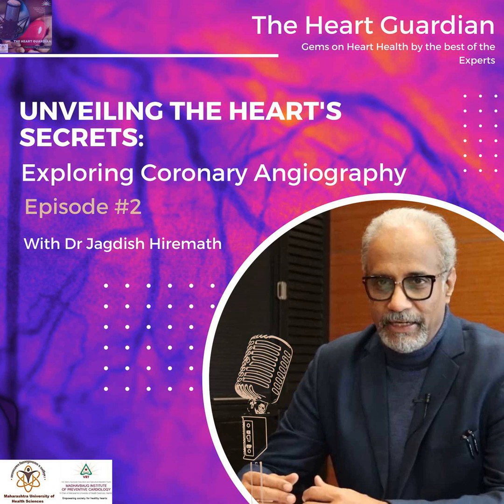Having secured this position, iodine-rich contrast is injected in the catheter. As it travels through the coronary artery, making it radio-opaque, a video is recorded. We do that about 6 to 8 times in various angles and views to get the complete information. This done, the catheter and the cannula are removed.